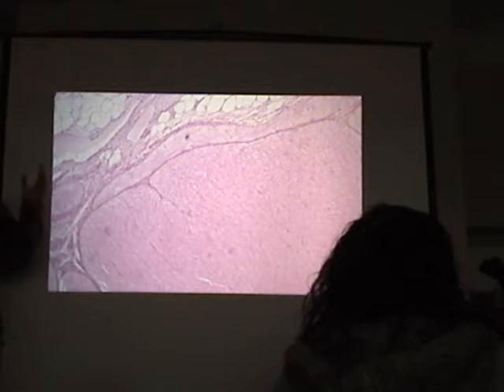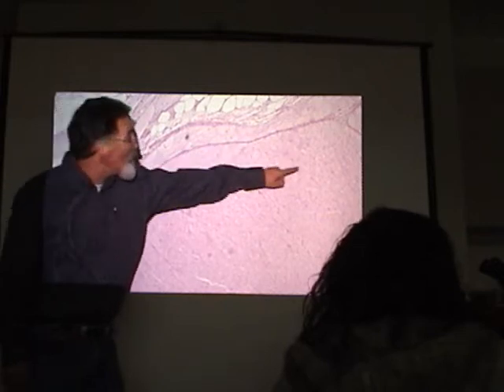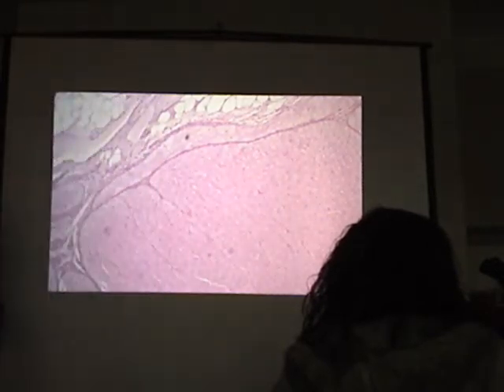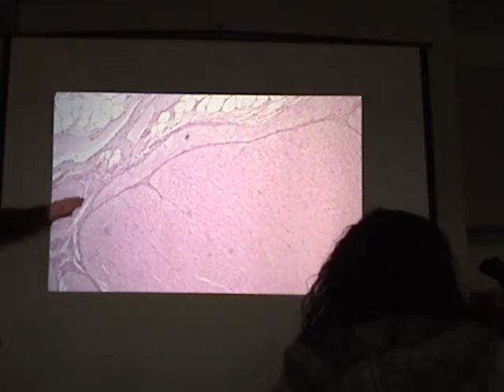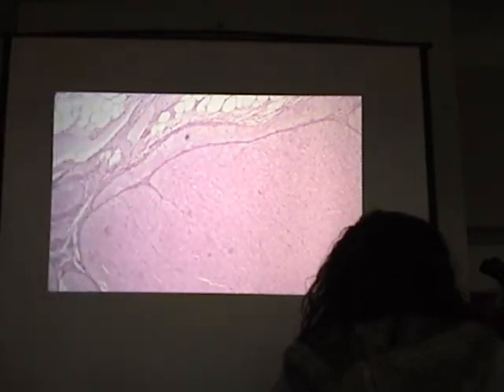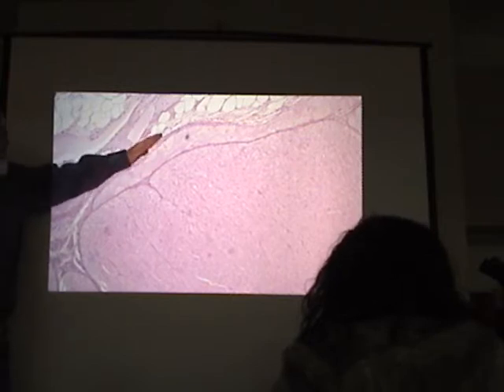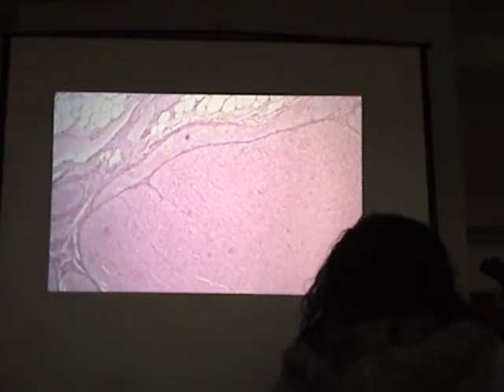That can be useful if you're looking at cardiac muscle where you have cross sections. Like out here, you can see the halo there. So you've cut that longitudinal fiber in cross section. You have the nuclear profile and that little white or clear halo. We also have what in this? Purkinje fibers. Usually they run right below the endocardium; this looks more like an adventitial setup.